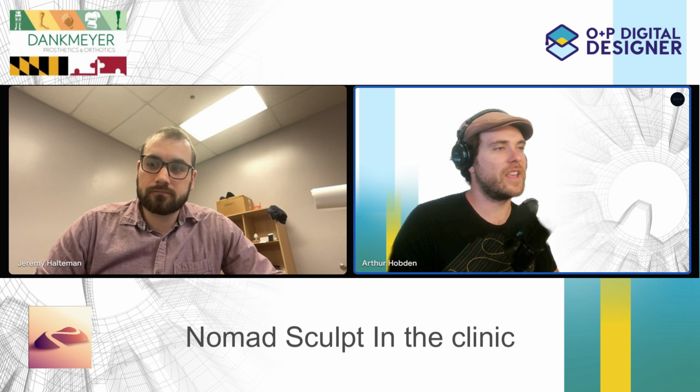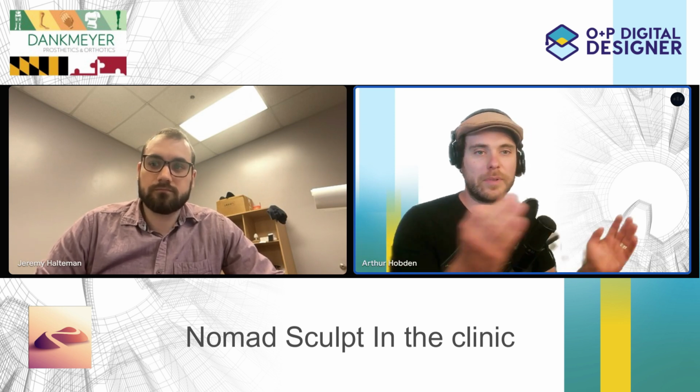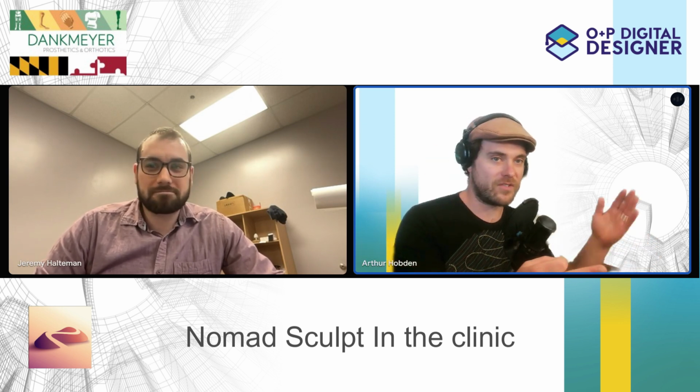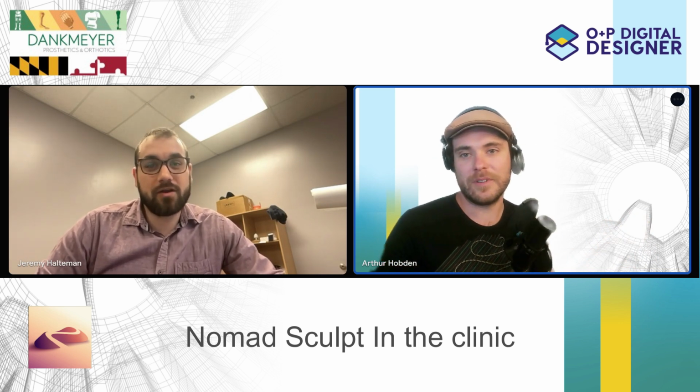How much of Nomad Sculpt's arsenal can you use to actually design devices? To me, everything Nomad does is up to the plaster positive, modified plaster positive, and then you transition to CAD software to carry through a product design. But is that division blurring with Nomad? Oh yeah, it's blurring. It's not a hard stop, for sure. We can and do an increasing amount of end design in Nomad. Yes, there is an element where you need other CAD software to generate some files. We'll generate other CAD files, export STLs, and bring them into Nomad to work.